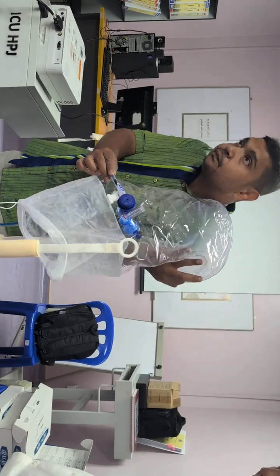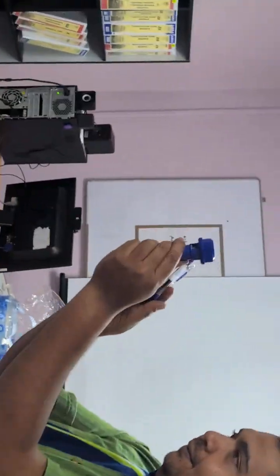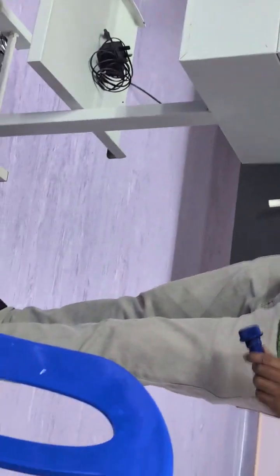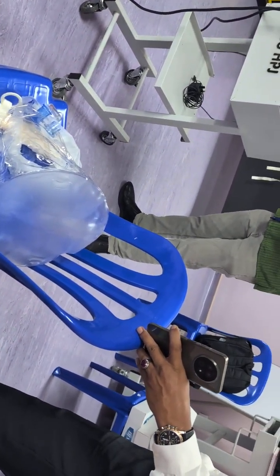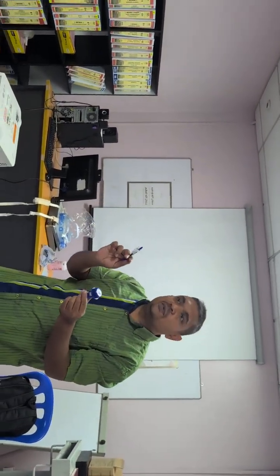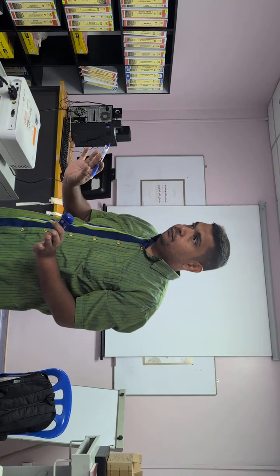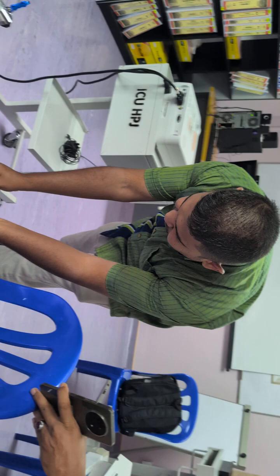You see this hole here? Okay, why bother? Here. You see this hole here? This is where the CO2 comes out. Okay? And you heard the noise just now, right? The number one indication is there's no more noise. Number two, don't worry. The CO2 still goes out from here. But, I'm giving you less than 30 minutes. Okay? After that, definitely poisoning. For sure. For sure. That is another disadvantage. Alright? Any questions?